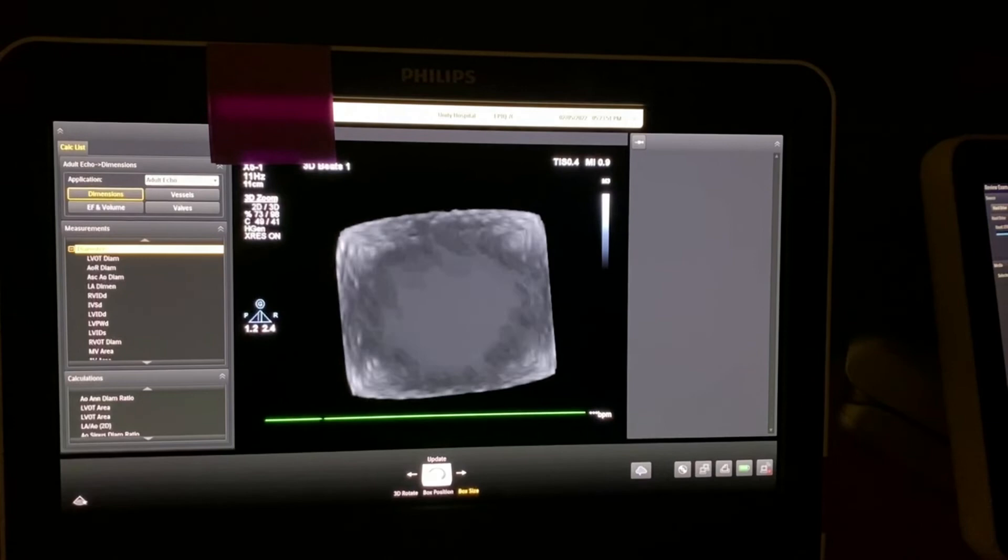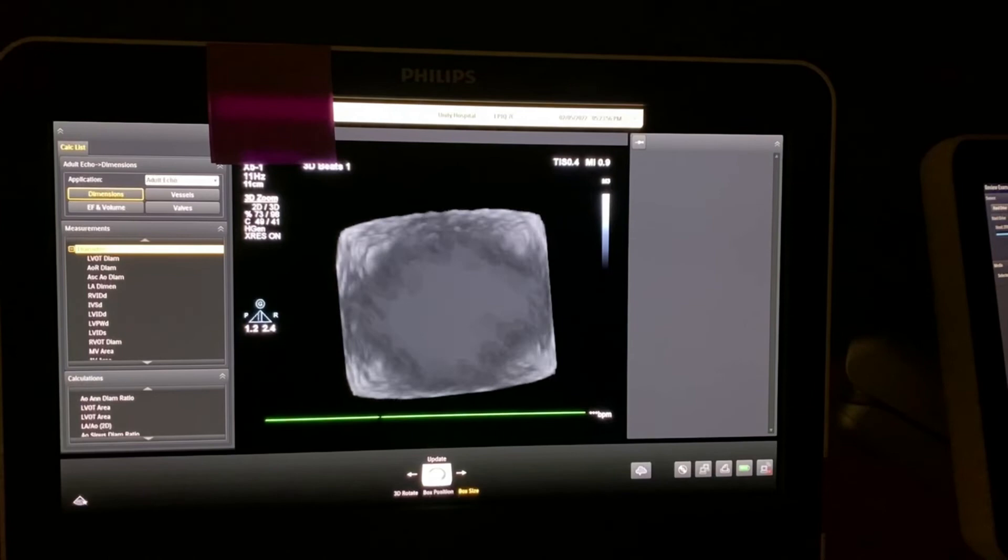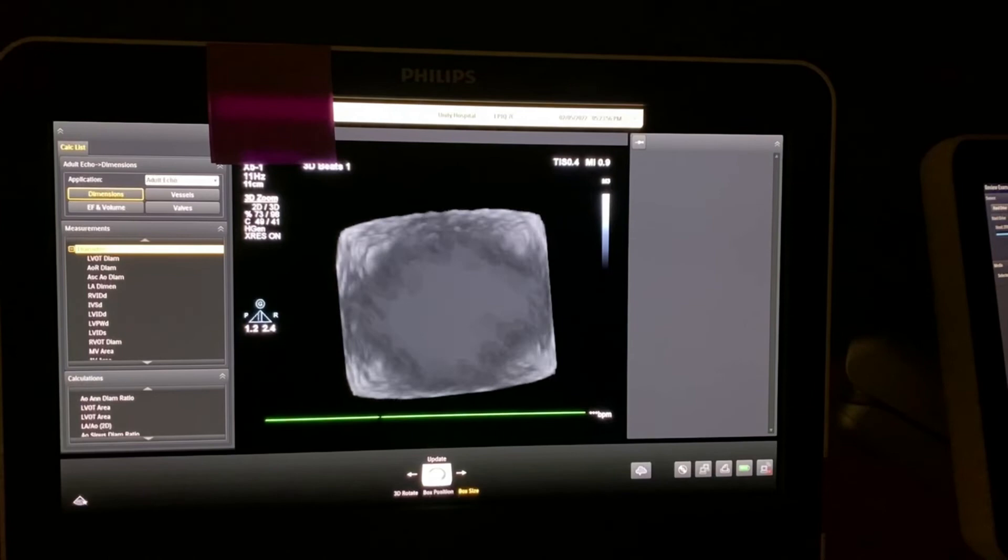We'll use these terms—medial, lateral, anterior, posterior—to help direct our structuralist as they're doing their mitral clip. So this is a quick view on how to acquire a 3D zoom image, and I'll show you an actual example in another video.